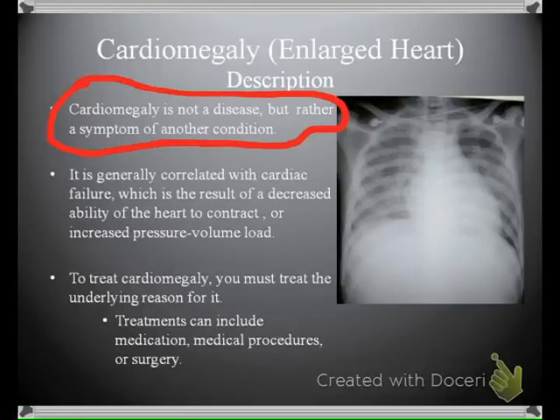And many times we look at a basic chest x-ray and see cardiomegaly. This technique, which is probably a portable, we see that the heart is very much large in relation to the chest, and that is the surefire symptom of cardiomegaly. However, many times portable techniques amplify and magnify the heart, increasing its size in relationship to the chest.